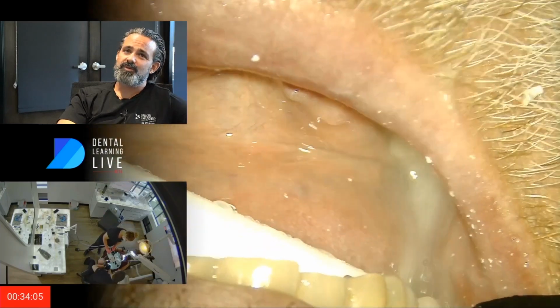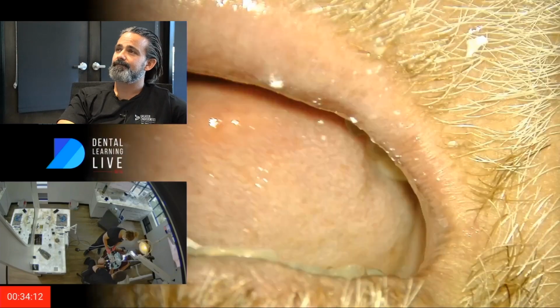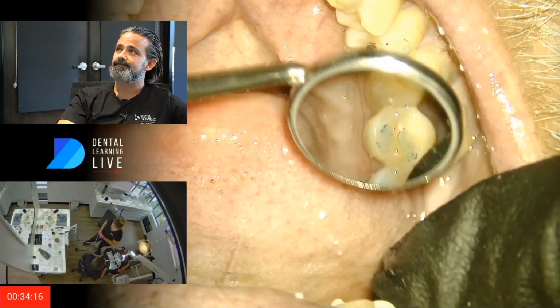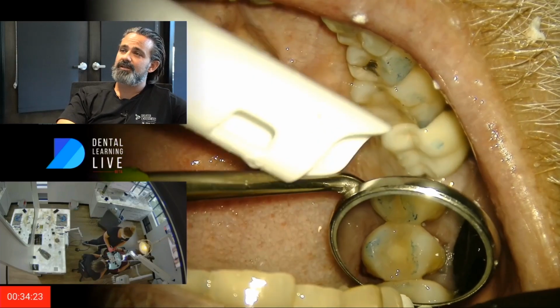Yeah, the problem when you do put the putty, you have to clean it up, but I don't mind that. All right, I want to make sure that's not in contact. We look good.